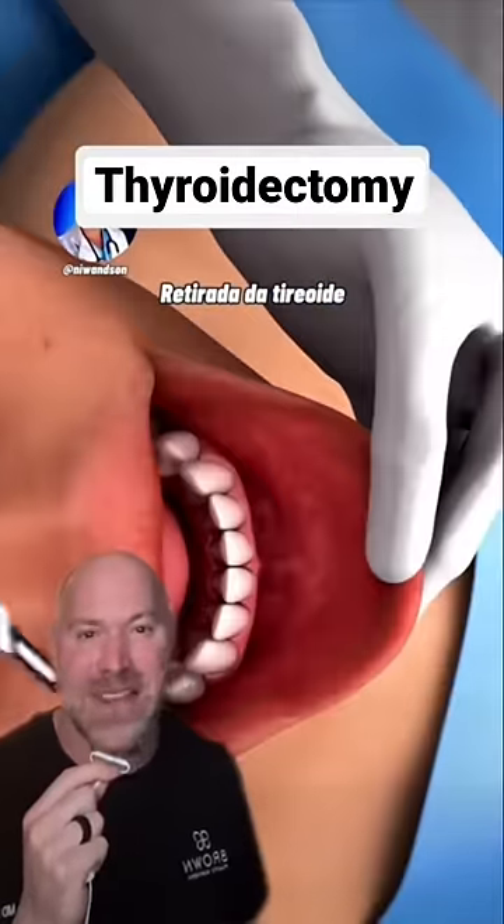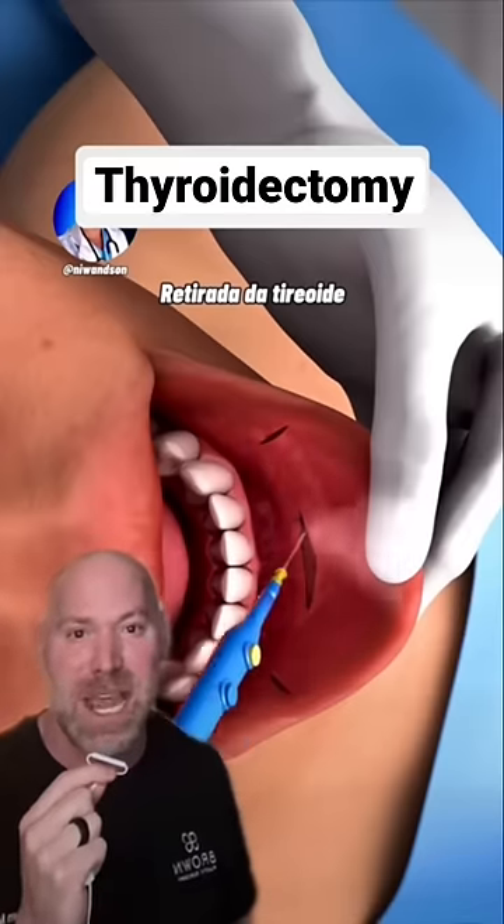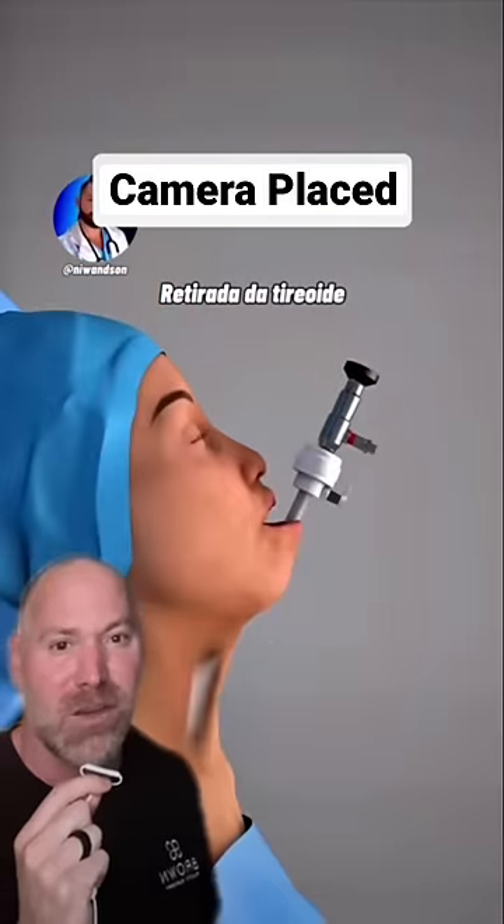This is crazy. We did not take the thyroid gland out through the mouth when I was in training. So they're making two working ports and a camera port. They're going to place a trocar in and the camera then goes right down under the skin.